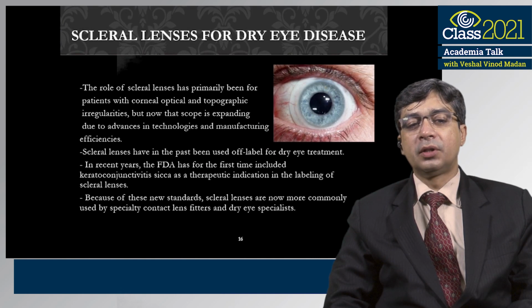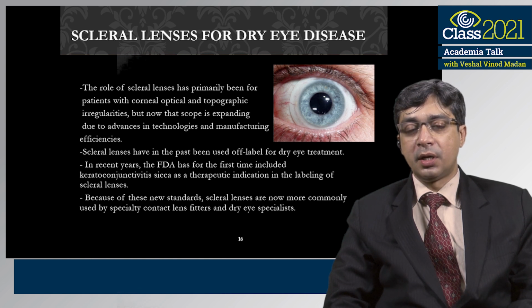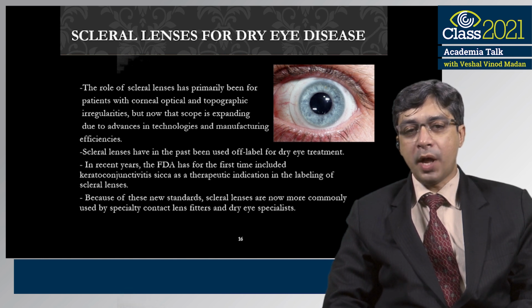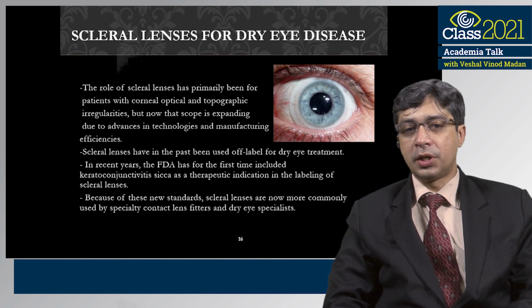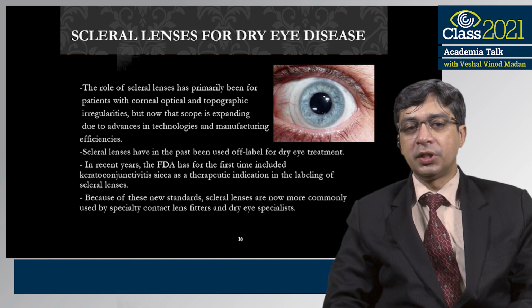Scleral lenses are very much in trend, and they are shown to have very promising results as far as moderate to severe dry eye conditions are concerned. Scleral lenses are highly safe and have ample benefits, with good optical as well as physiological properties, and they have been shown to alleviate dry eye where other therapies and management procedures fail.